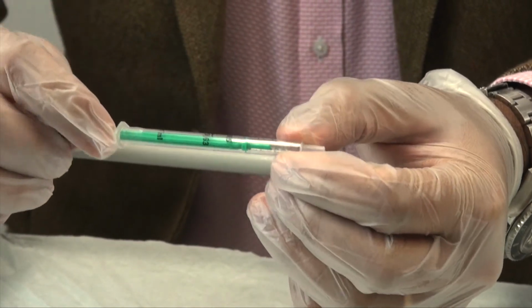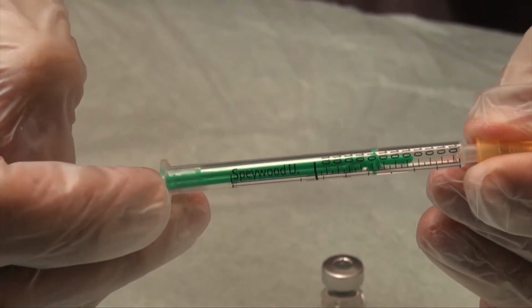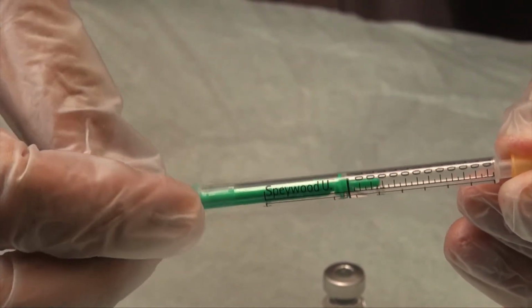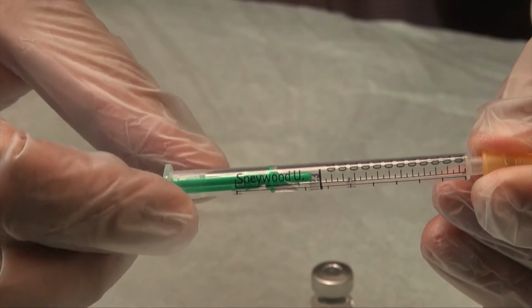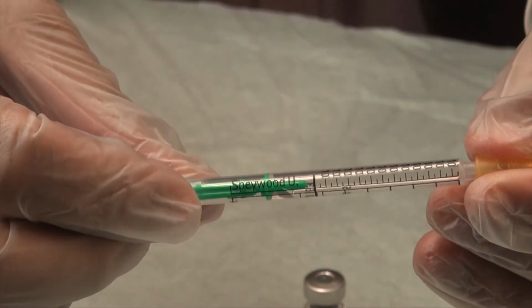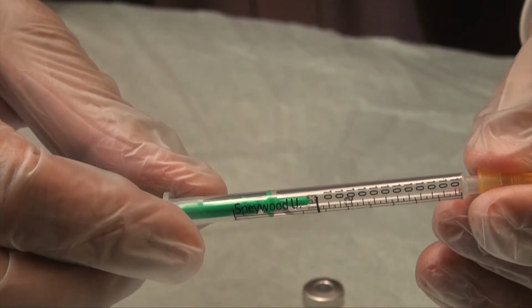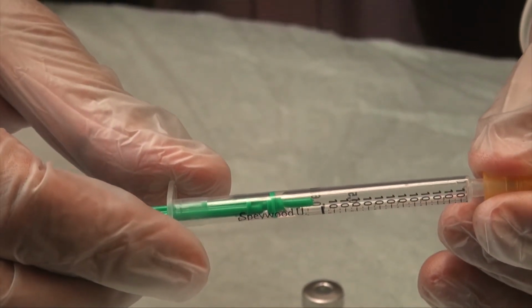But as you can see, if you zoom in on this, and I remove the plunger, it has a large bar marking at 0.63 mils.